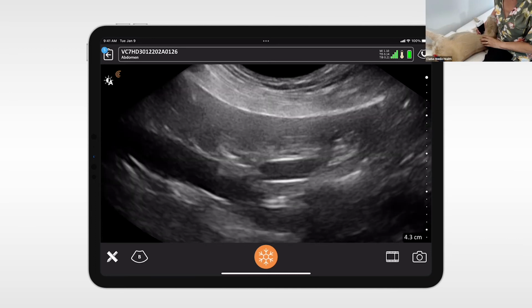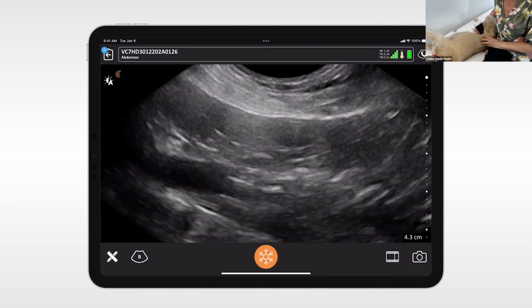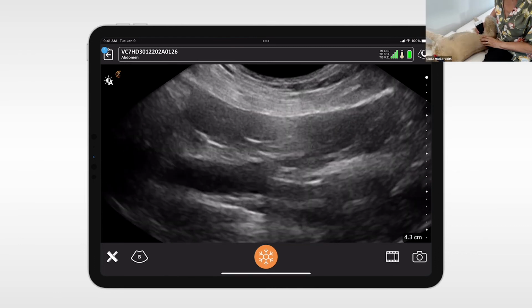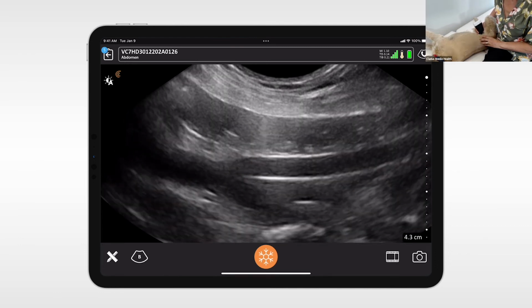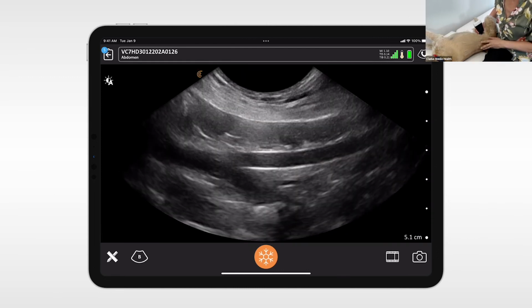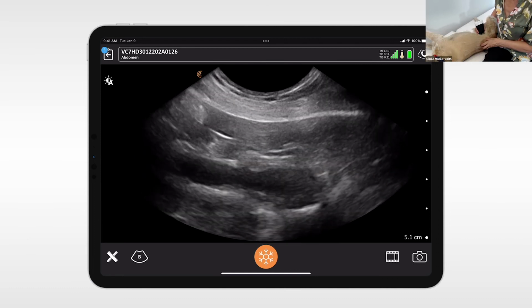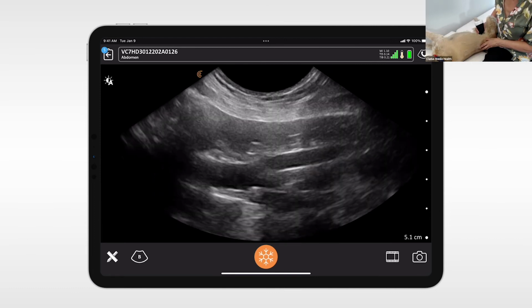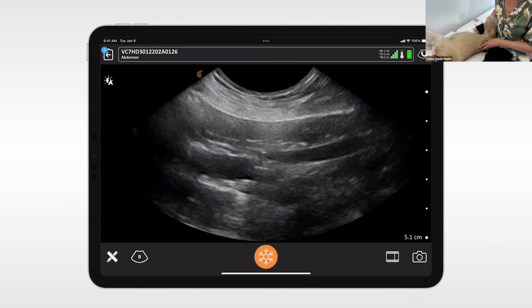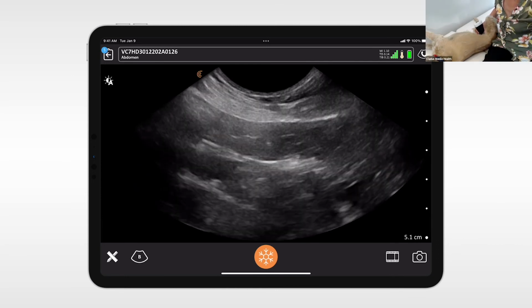Yeah, definitely. That's fine. I won't necessarily find both of them every single time, every abdomen that I scan, but I will look for it. And I feel fairly happy if I found in that area at the aortic trifurcation that if I'm not seeing anything there, then the lymph node is very likely to be normal. Okay, good.